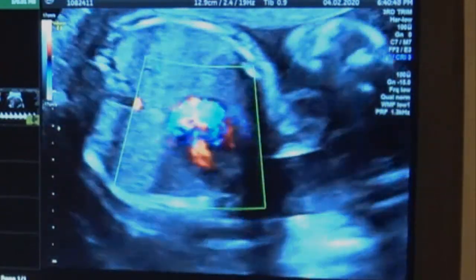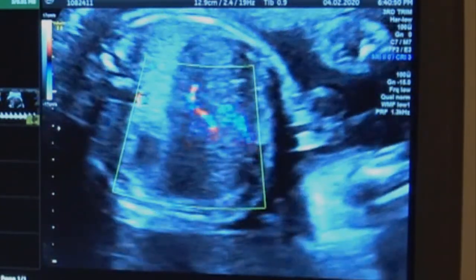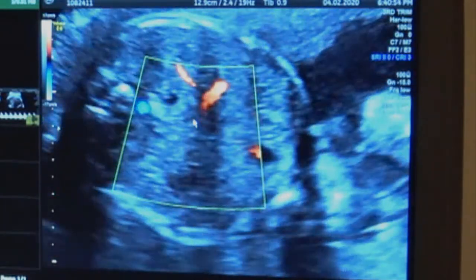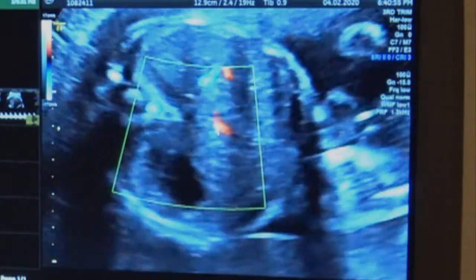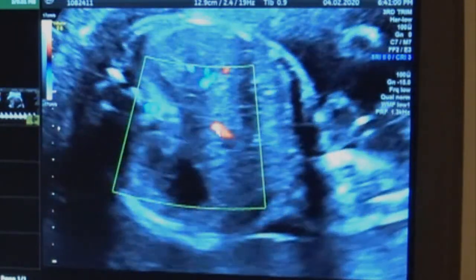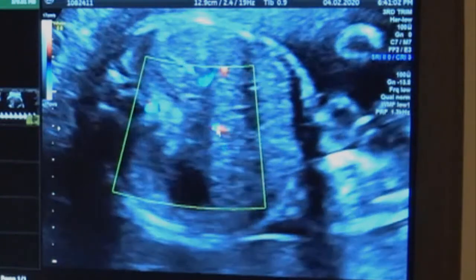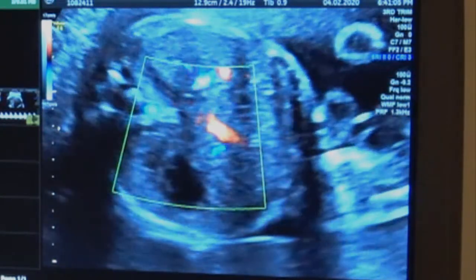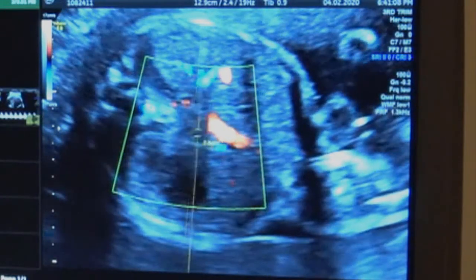That's going towards the head. It's just tiny under that. See that there? That is it. It's like a tiny colour little vessel. Gain the colour up a bit. Yeah, it's just the teeny thing. Yeah, it's tiny.